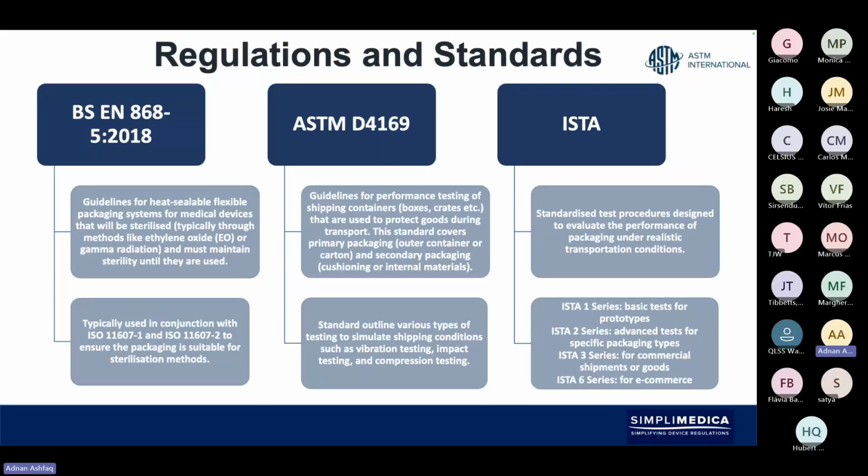In some cases, over-radiating the seal can have an effect of over-sealing or strengthening the barrier, which causes further problems because we want to make sure that the sterile barrier is intact, but the seal strength doesn't go beyond a certain limit and it doesn't go below a certain limit. So these standards are here to define some of those parameters and acceptance criteria.